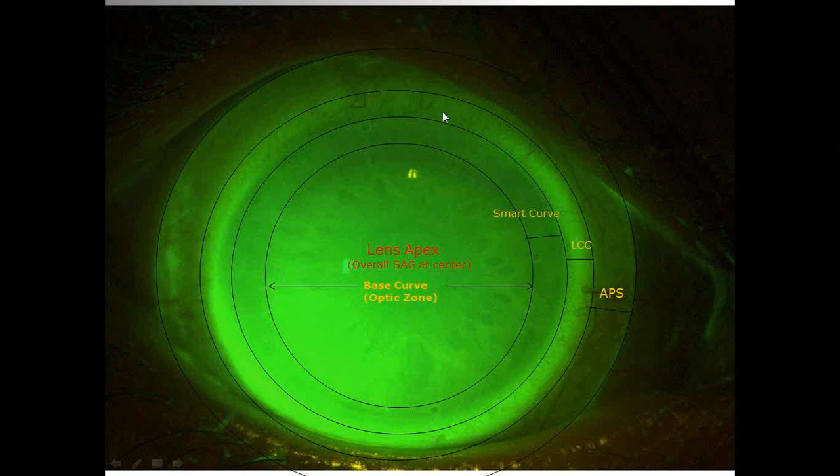Dr. Jodlicka, I'm going to ask a question here. One of the most common issues that doctors ask us about in consultation is when they're evaluating the diagnostic lens or the patient's lens on follow-up. Very often they'll describe this thinning. You can see here where there's a little less fluorescein superiorly, especially toward the limbal region, compared to what you see inferiorly. And I think that's typically due to that little bit of downward decentration that occurs with, I think, the majority of scleral lenses. Can you comment on your thoughts when you see that and what you might do to evaluate whether or not that's something that needs to be modified or resolved, or when is it acceptable?